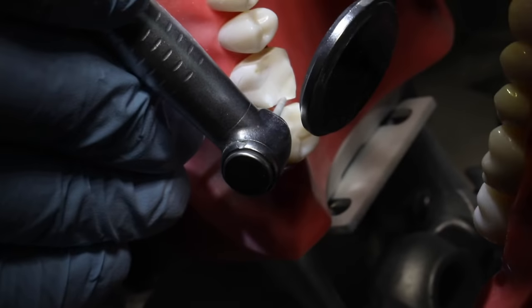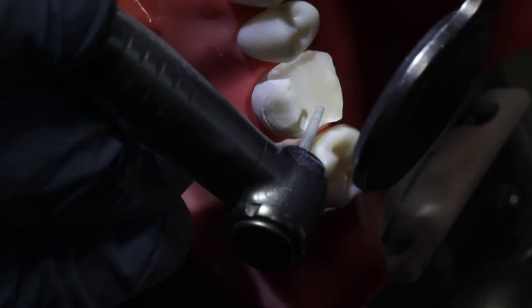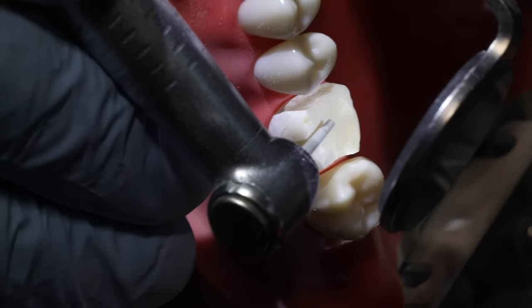And now that the proximal contacts are broken, we can really finalize this occlusal aspect of our preparation.